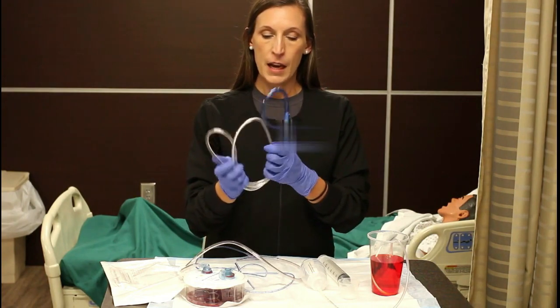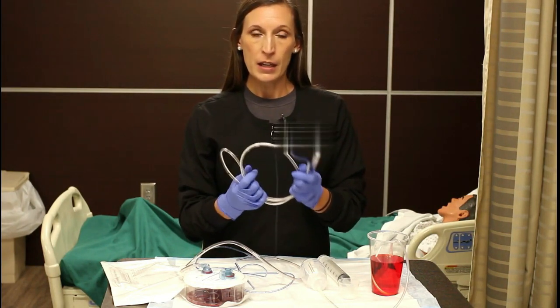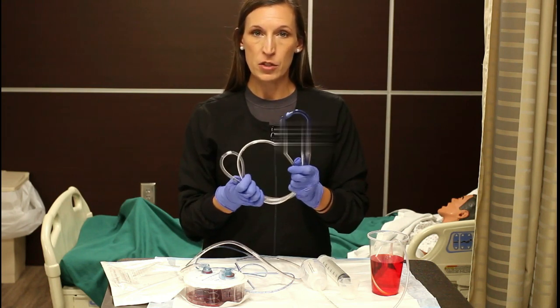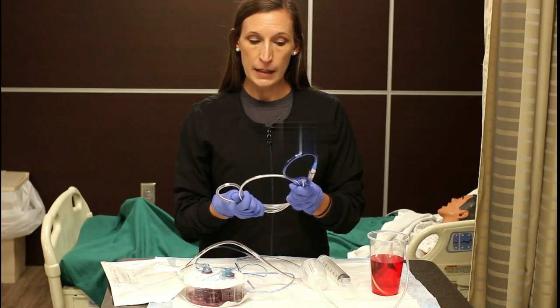That is the Salem sump tube. It is used for gastric decompression, which means to relieve the stomach of air or fluid contents.